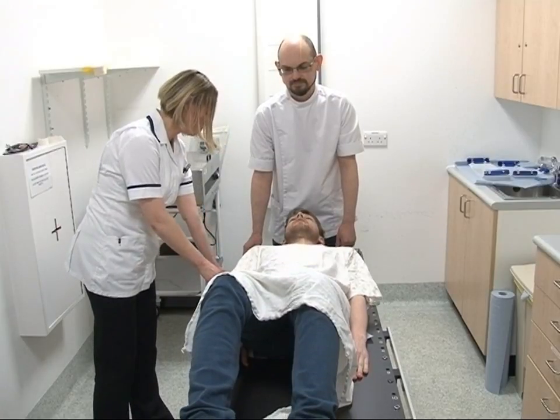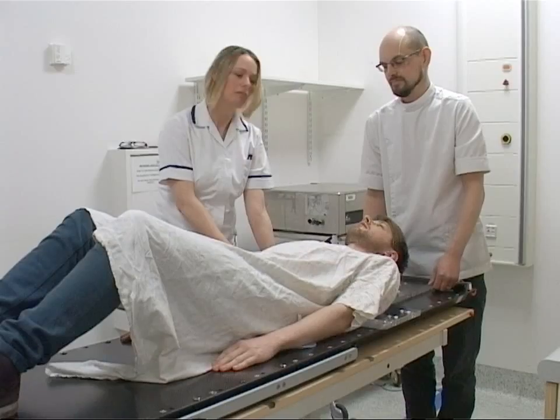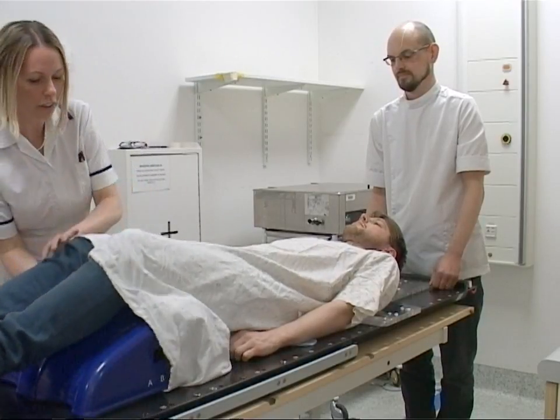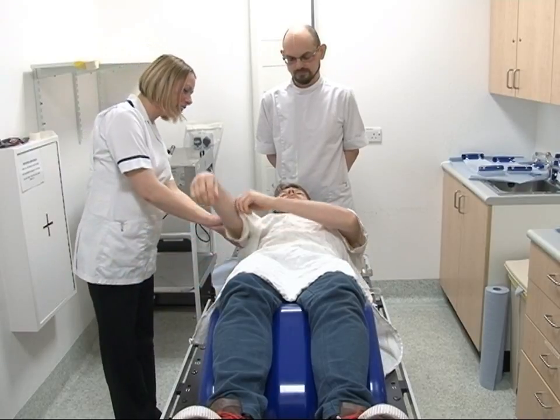It takes about ten minutes to make a thermoplastic mask. A support will be placed underneath your knees to make it a little more comfortable. You will need to take your arms out of the gown.